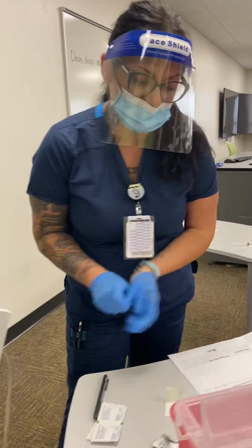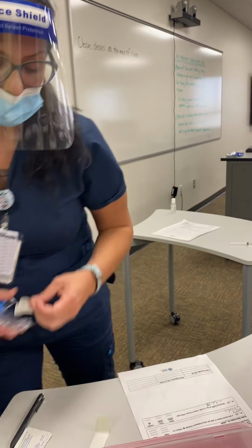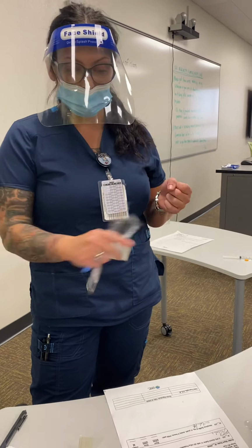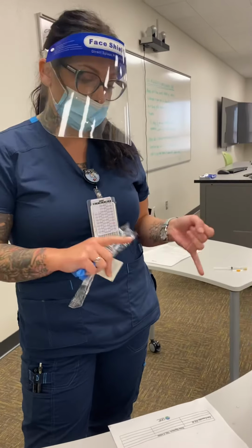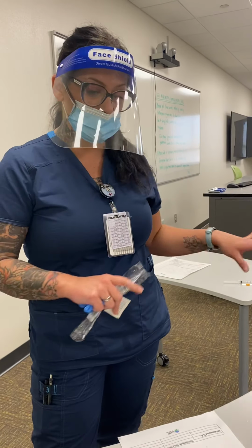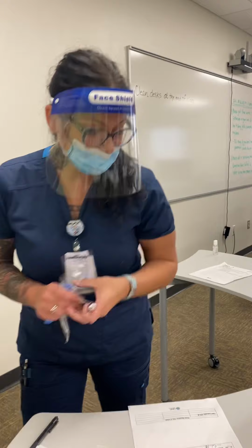Okay, so doff my gloves, clean my station. I need to document everything that I've infused, the type of fluid that I infused. I need to include all of the saline flushes, amount of fluid that I infused, how the patient tolerated it, do a quick mini assessment to see how she has reacted to the treatment. Document that as well. And I think that's everything. Oh, and of course I would throw this in the sharps if it was empty. If not, I need to go back to the med room and waste it with a second nurse to confirm. And I think that's everything.